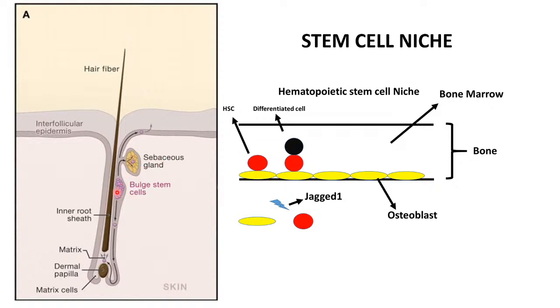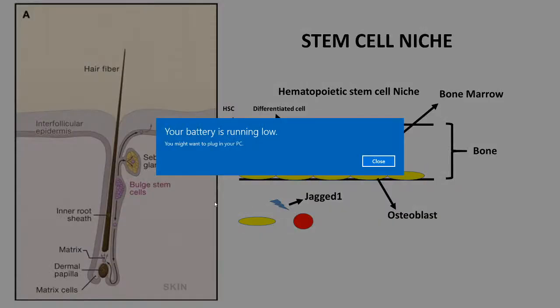Then what do I have to learn? I have to stop all the cell signaling molecules and growth factors which were coming from here, which I was giving initially, and replace them with the growth factors and signaling molecules present in this environment. If I want to convert them into these cells, then I have to change the environment of my culture media.